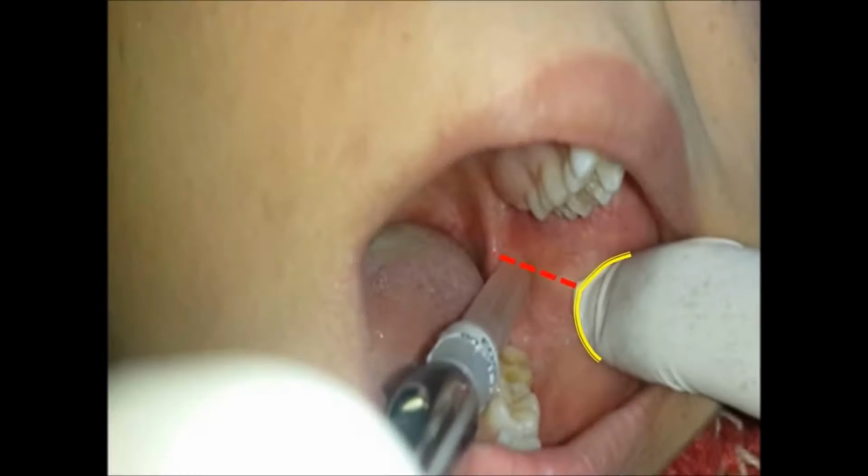The exact entry point is the intersection between the line we drew first from the height of the nail tip and the pterygomandibular depression. Right now, the needle tip is at the exact entry point.